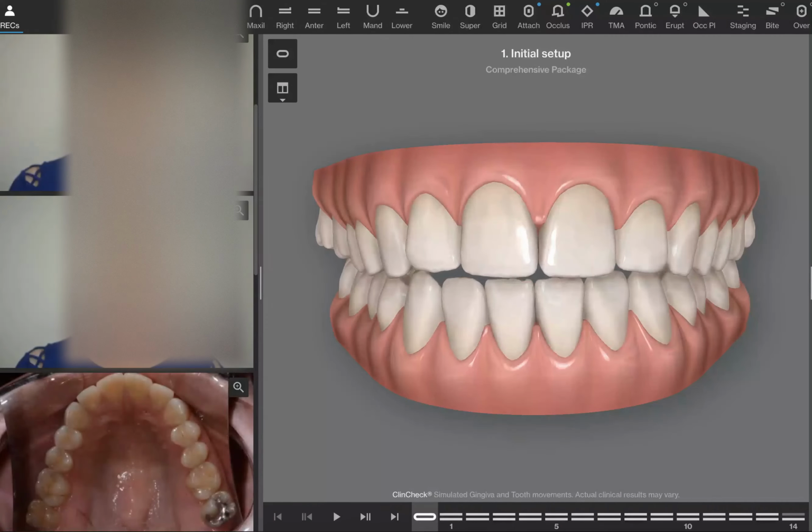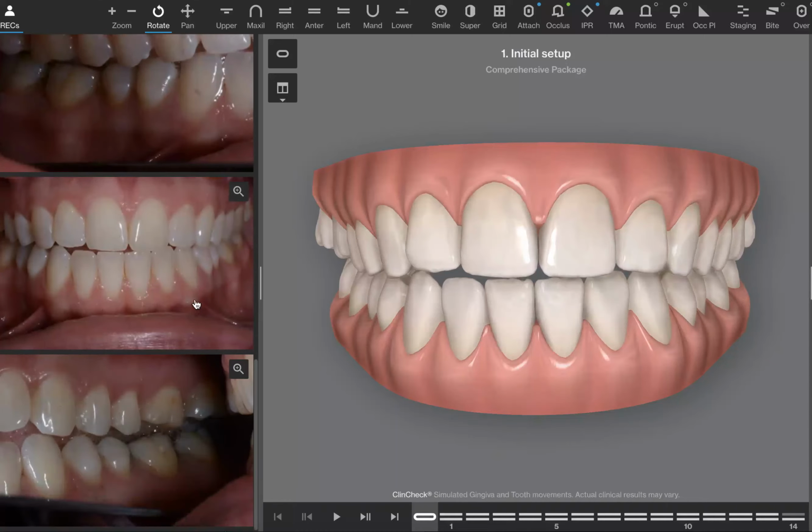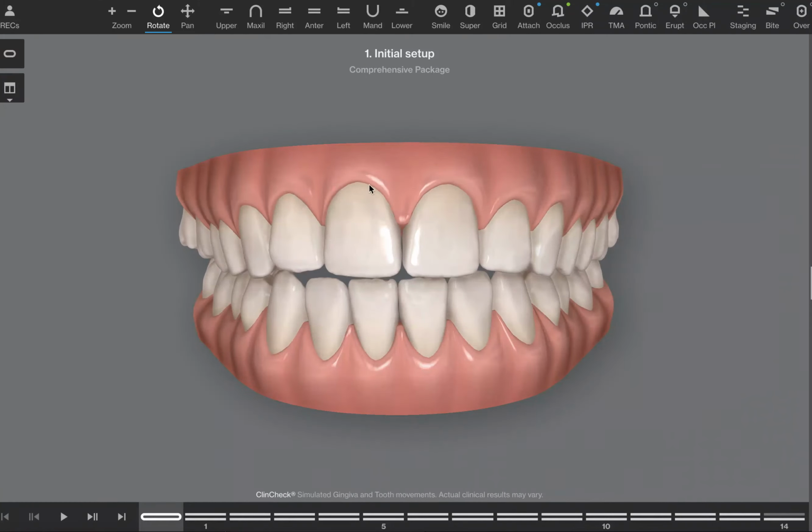Yeah, they look pretty good. I don't think there's any need for us to pull those teeth down. A lot of times what I'll do in cases like this is put elastics on the teeth and pull the upper front teeth down so that the gum tissue level is level all the way across. It's a somewhat difficult movement to do. In patients that have airway issues, it has a higher degree of relapse. The teeth look great in your mouth.